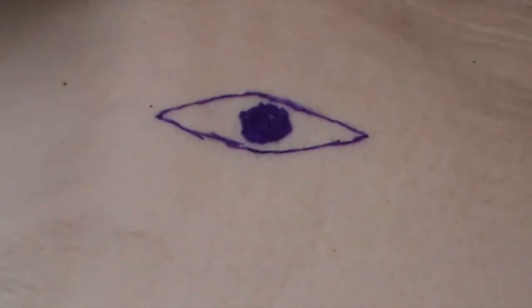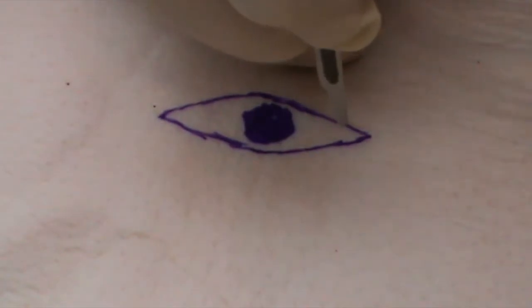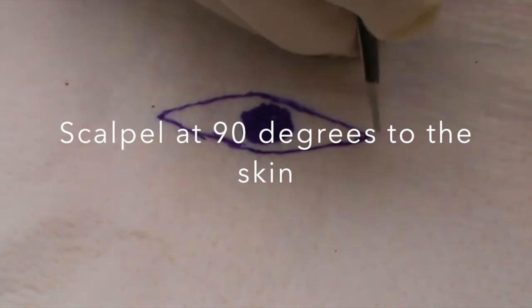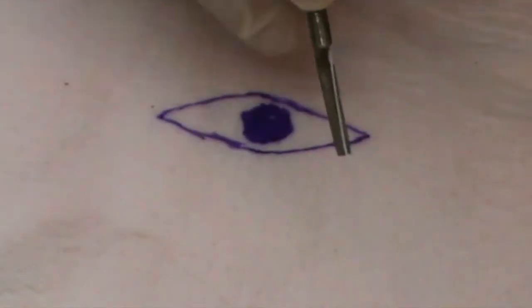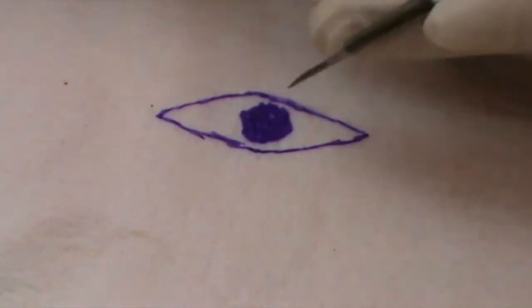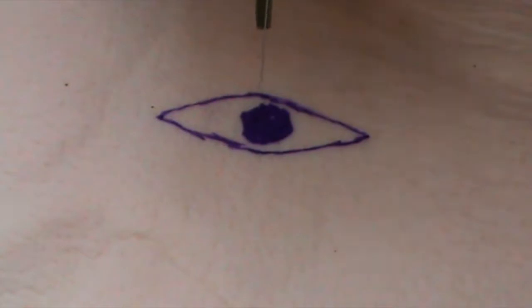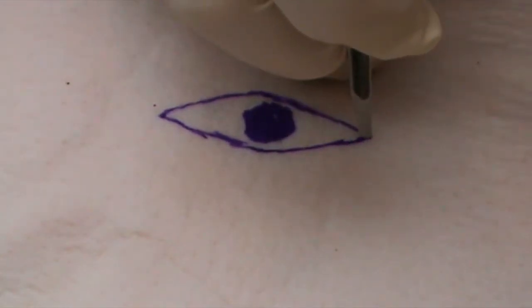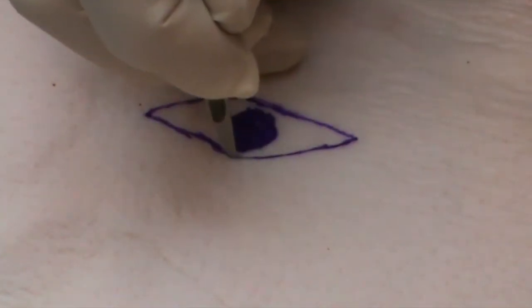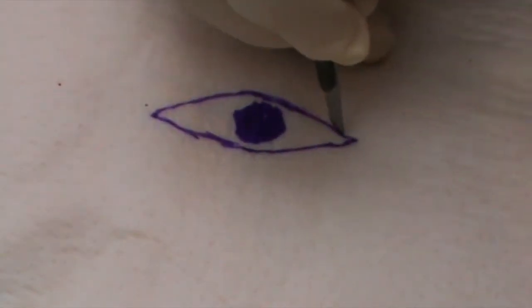When it comes to excising an ellipse, remember the rule of 90 degrees. We want to have the scalpel at 90 degrees to the skin. The temptation is if you're operating like this, you will tend to operate either that way if you're right-handed, or that way if you're left-handed. But what we want is to operate at 90 degrees. We start at the apex, heading around the pre-marked ellipse that we want to excise. Note that we're cutting around the outside of the marked area.